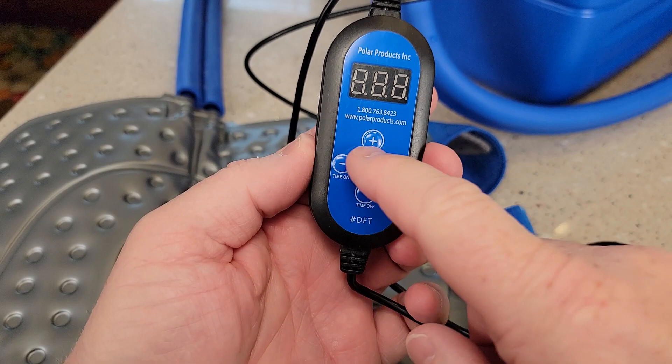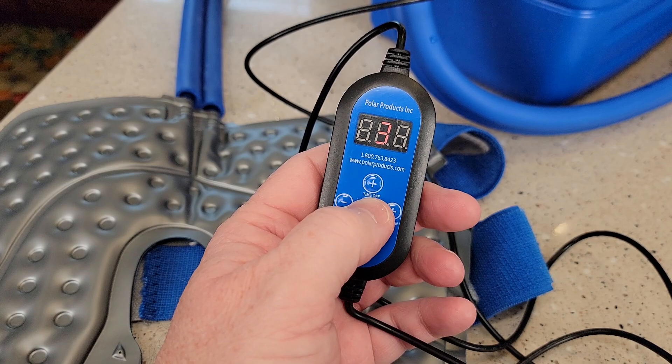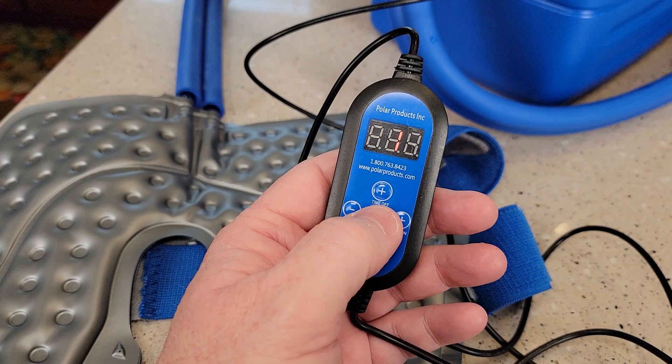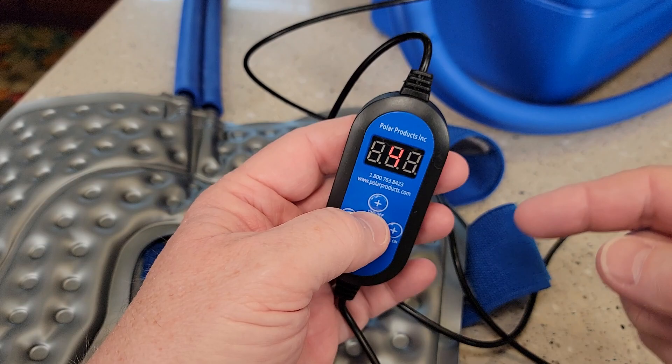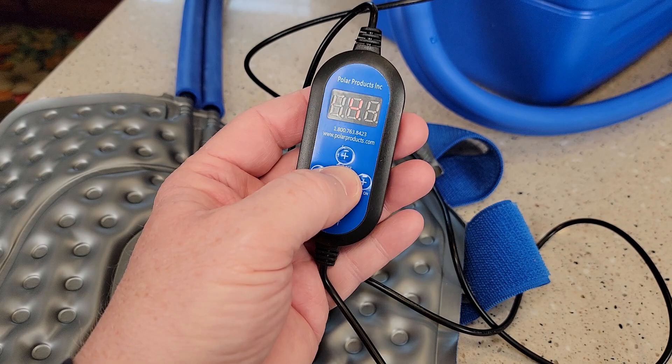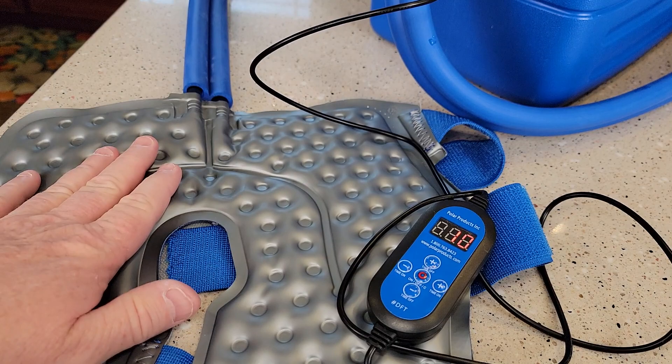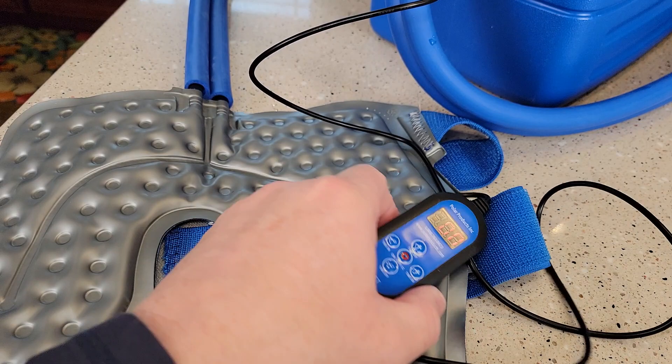So let's go over the controller. You turn it on with the center button. Now it's going to start off at four, but if you press it again it's going to go to three, two, one, and zero is off — that's how you turn it off. Four is the coldest setting, three is not so cold, and one is the warmest setting. When you've got it on four, you can tell the pump is turning really fast, so it's going to circulate that cold water a lot quicker. When I go to three, the pump's not turning as fast. And when I go to two, you can hear the pump but it's turning noticeably slower, so the flow is going to be less. And that is very cold — you can see those inflate just a little bit with the water.